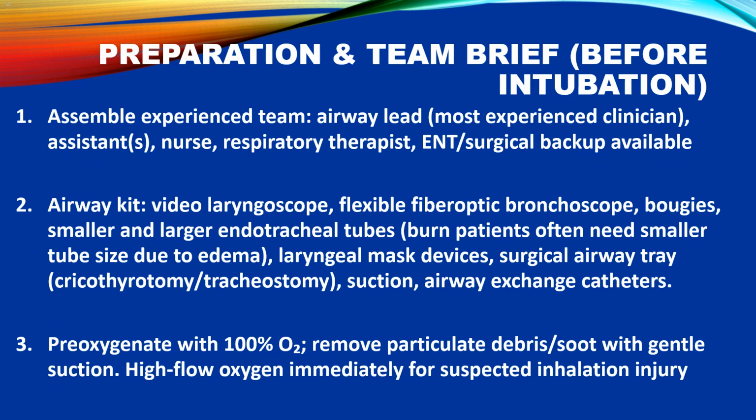Preparation and team brief before intubation. 1. Assemble experienced team. Airway lead. Assemble a team with an experienced airway lead, assistants, nurse, and respiratory therapist. Surgical backup. Have surgical backup available in case of emergency.